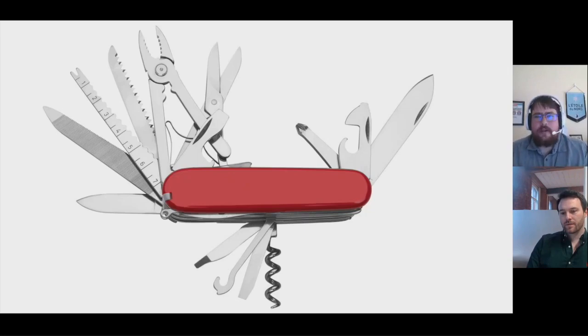What are you trying to do? That's always the first question I ask. If we're looking to just create anatomical models that have been segmented, that's where we go with PolyJet, because it creates these beautiful, almost pieces of art, that really help not only that patient understand the surgery they're going through, but that clinician to better understand where there could be potential risks as they go in.